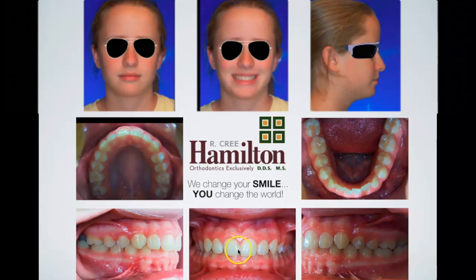Yeah, we're really close to having a perfectly on midline, which tells us that, in all likelihood, that patient was shifting. Now, again, in my opinion, this is the exception, not the rule. Most of the time, when a midline is that far off, and I'm assuming that midline's been off since she was 6, so that's almost 4 years, 6 meaning when those molars came in, and maybe even before that, because the primary teeth were in crossbite as well. But at least from 6 to almost 10, that patient was in a functional crossbite, and presumably had a pretty big CR-CO shift.